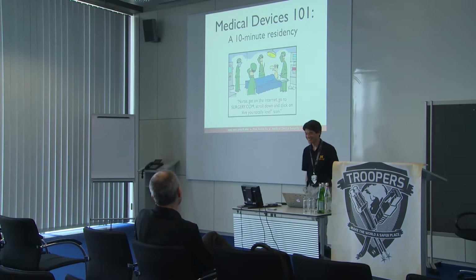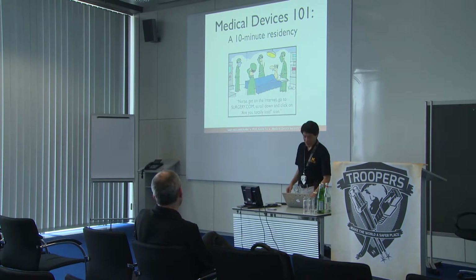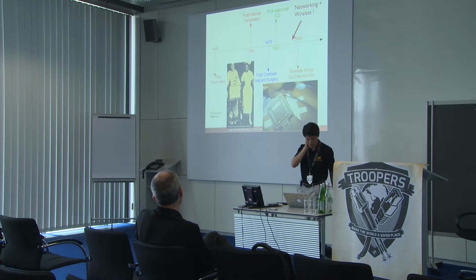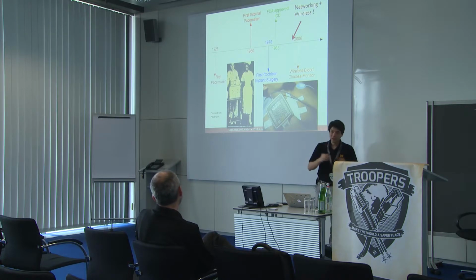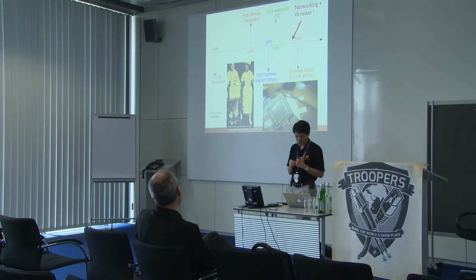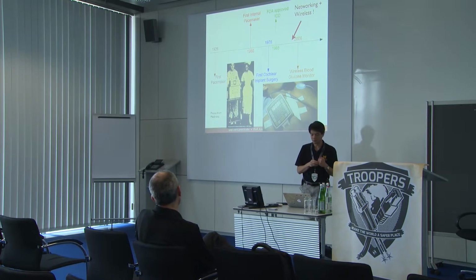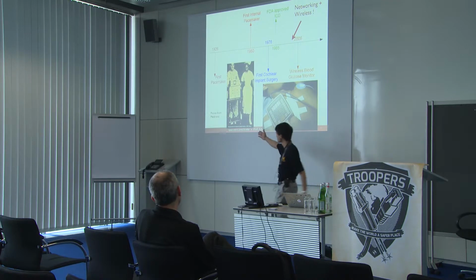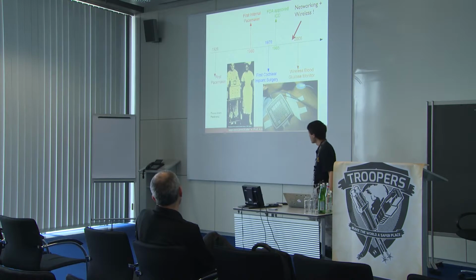Yeah, right, okay. So, anyone here a physician? Okay, all right. Well, you're all going to become sort of pseudo-doctors at the end of this, at least as far as implantables go. So, let me give you a quick history tour of pacemakers and defibrillators. About 50 years ago, the first pacemaker was implanted. It actually used to be a rather large external device. You needed a big burly nurse to actually cart it around for you, and the batteries were external.